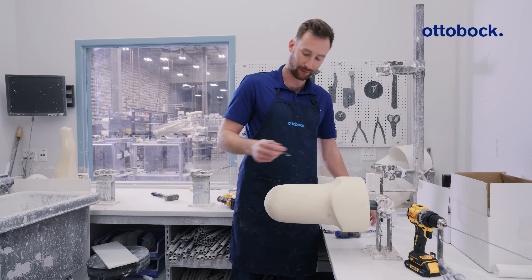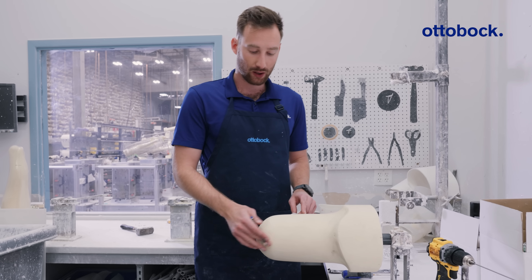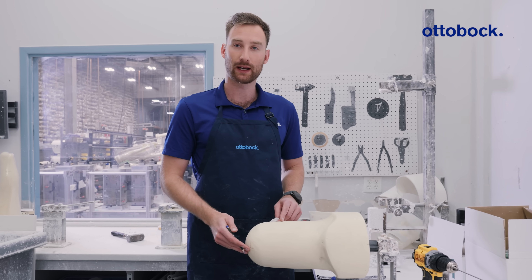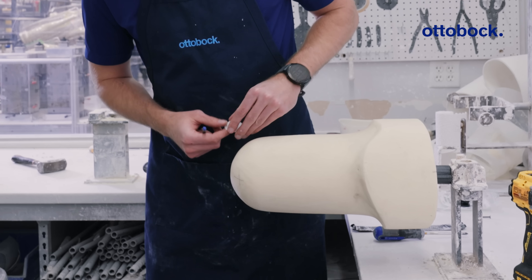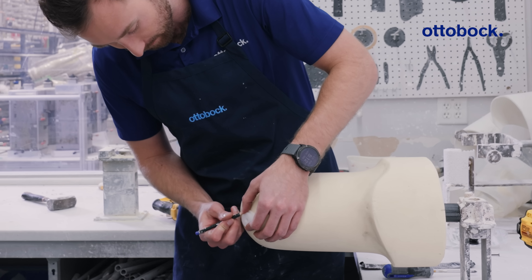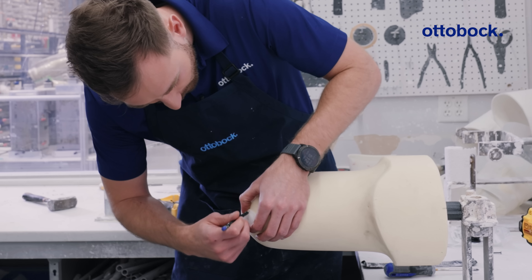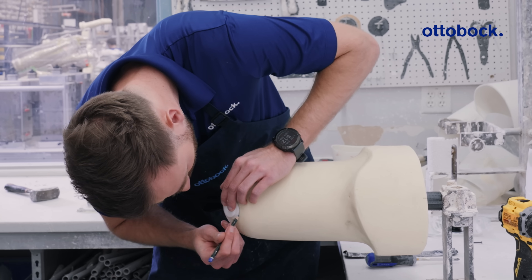The first step is to identify where you want to put the dummy. For an above-knee model, we generally want to aim for the distal medial area of the residual limb. I'll take my round dummy — I have an X already drawn to mark the general area — and I'm going to trace it and draw a circle.